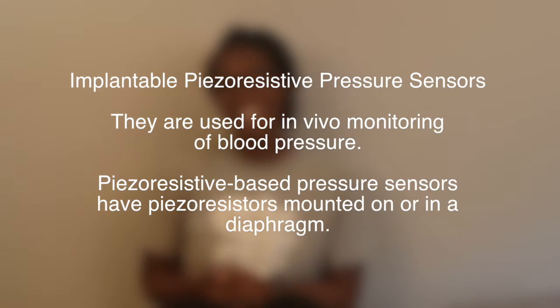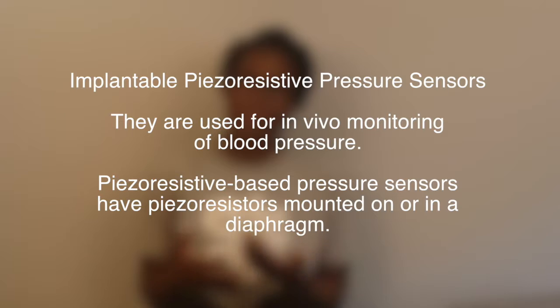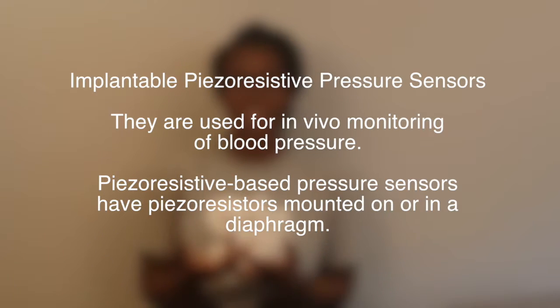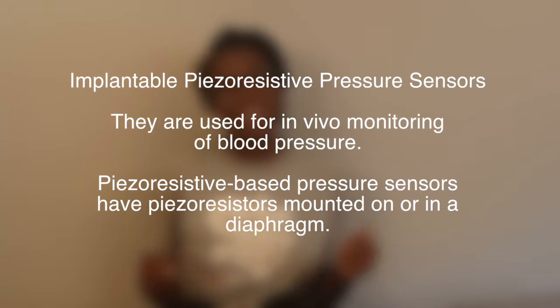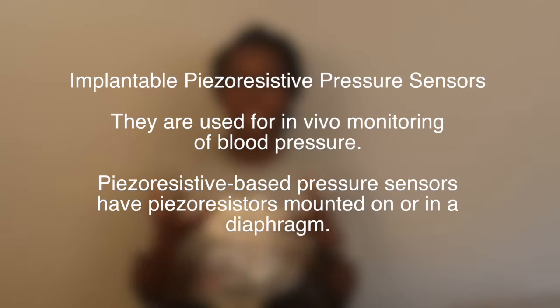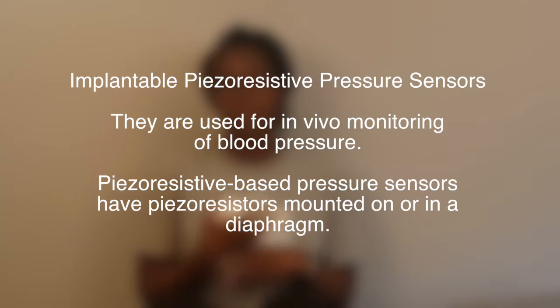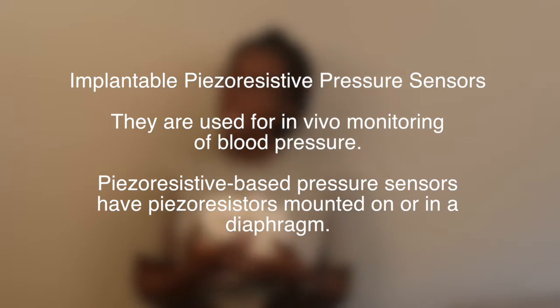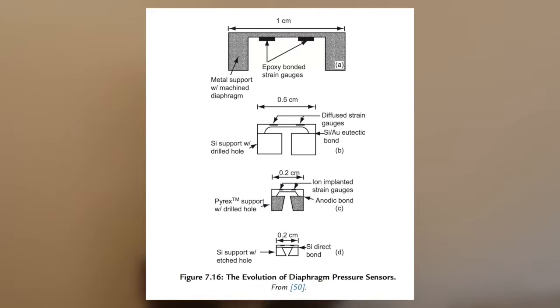Now, a type of mechanical sensors are piezoresistive pressure sensors. And these are commonly used for in vivo monitoring of blood pressure and are made of silicon. These sensors are positioned on the tip of the arterial catheter, and the catheter is just a tube that can be inserted in the blood vessel or the blood cavity.